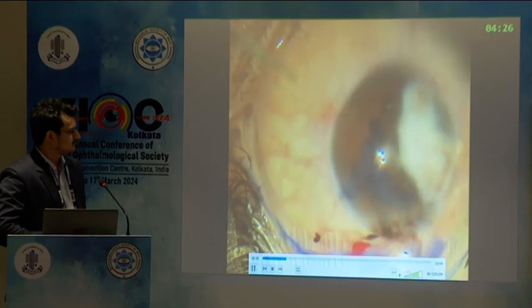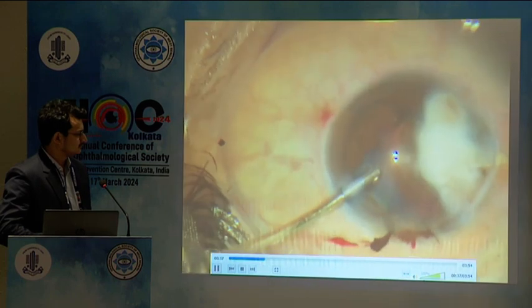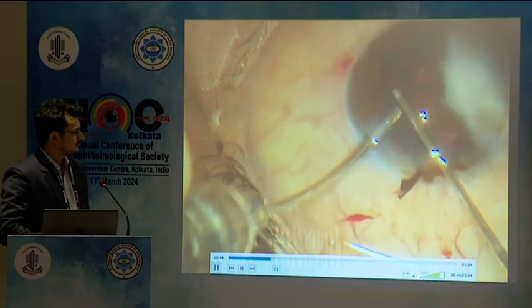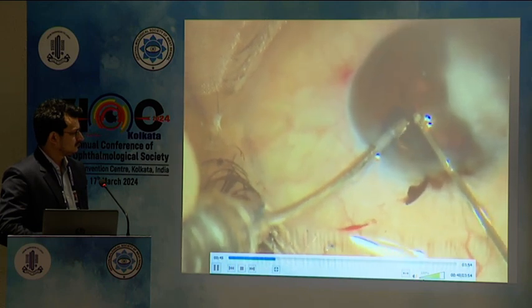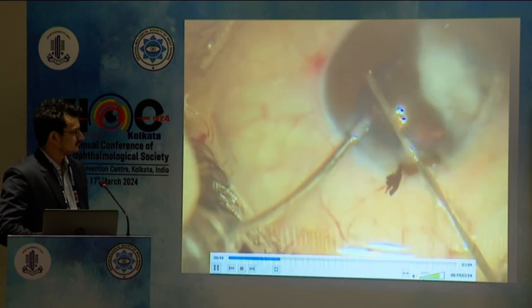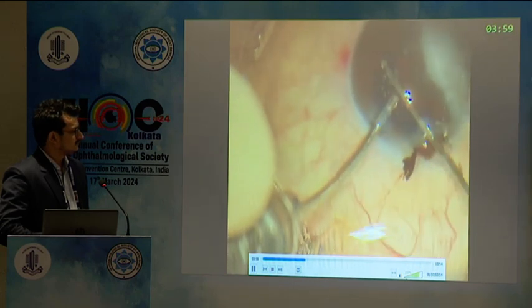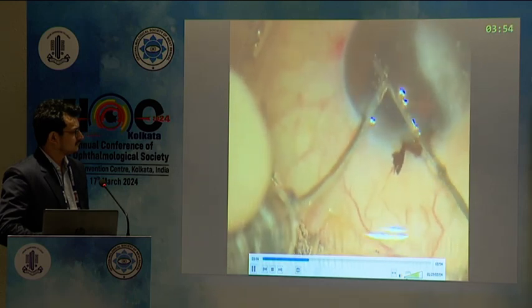Many times we will see the iris being myosed, which can either be mechanically dilated using viscoelastics or dilated using sphincterotomies. The free edges pose a threat to a later cataract surgery by repeatedly coming to the probe. So the edges can be trimmed using the cutter from the anterior vitrectomy. Aim is to attain a nice circular pupil.